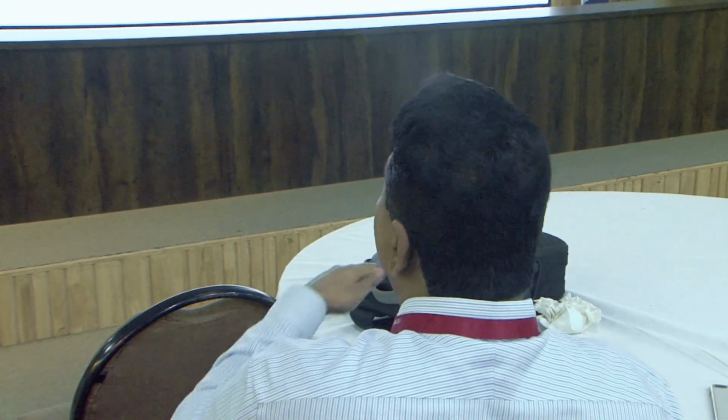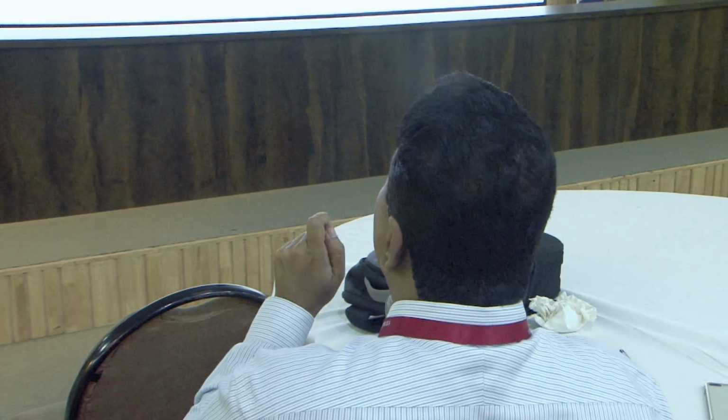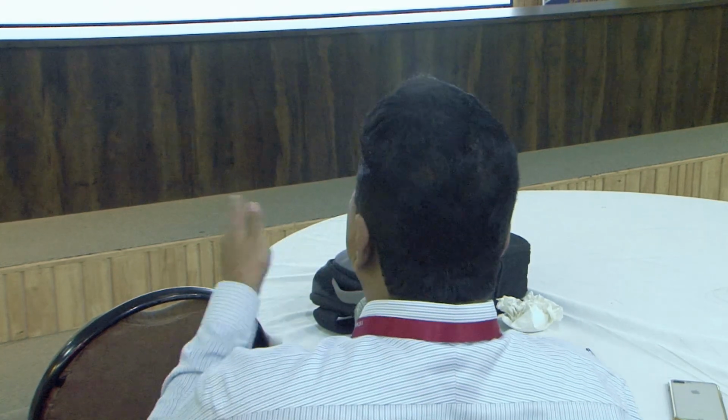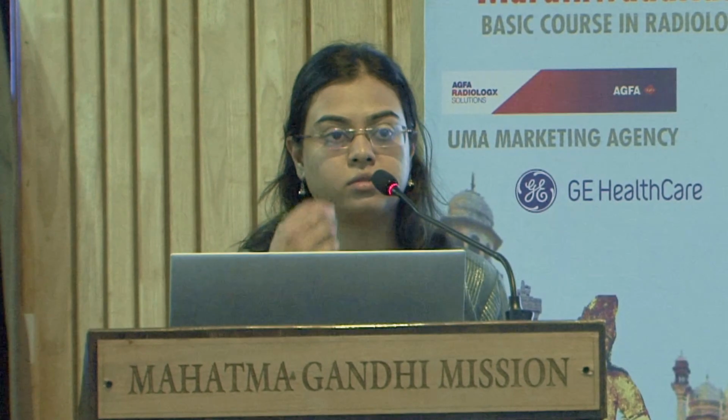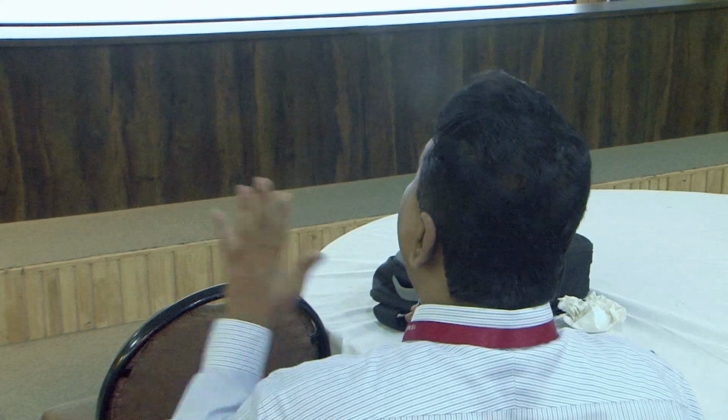Second, today you all do a lot of CT IVUs. In our time CT IVU was not there. At least now Ajay and all work a lot on it. There used to always be a question that calyceal abnormalities were better picked up on conventional IVU as against CT at that time. What is your current experience? Calyceal abnormalities: do you think conventional IVU still picks them up better, or has CT IVU now become the gold standard? CT IVU has become the gold standard. Yes. So it can even pick up calyceal abnormalities and everything now.